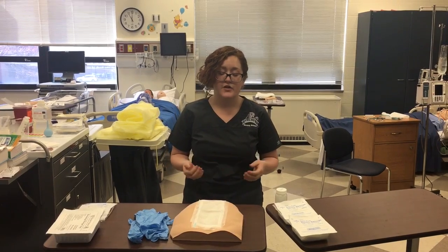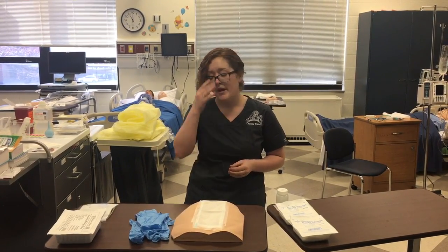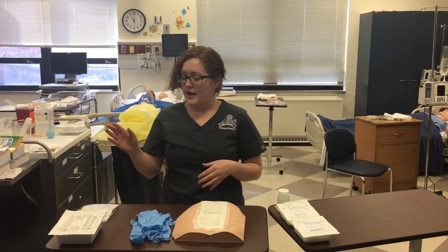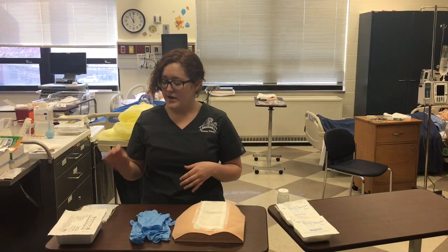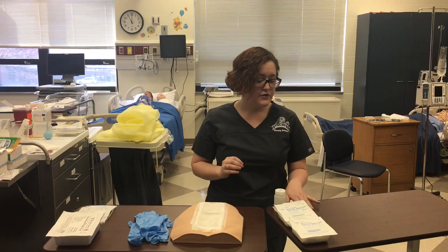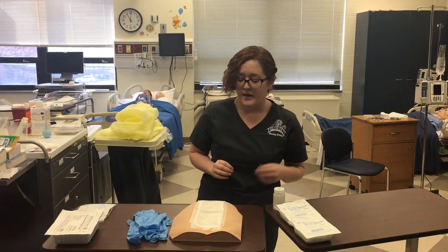First, whenever I go in, I'm going to assess the patient 30 minutes prior to the procedure, and I'm going to get them into a comfortable position. Next, I'm going to go and assemble my equipment. I'm going to get the dressing change tray, my sterile gloves, 2 pairs of clean gloves, saline solution, cotton tip applicators, and 2 packages of gauze.